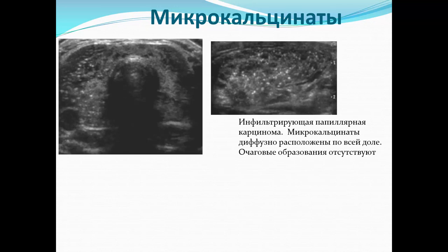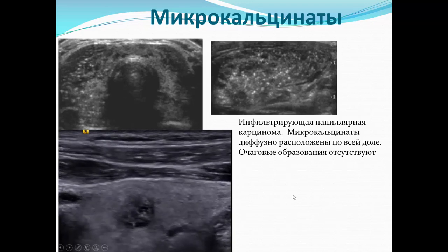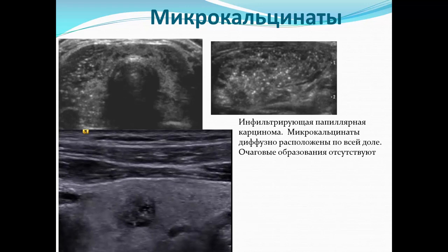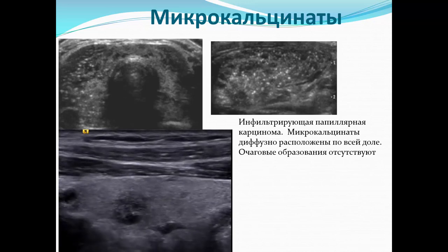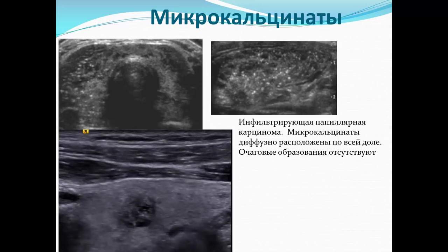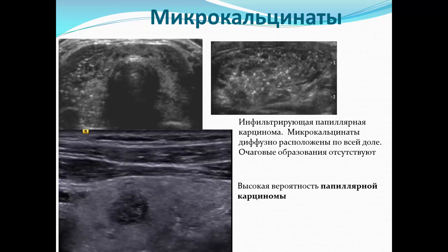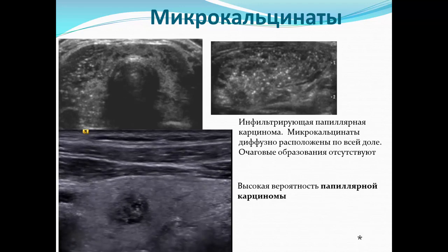Следующий пример — инфильтрирующая папиллярная карцинома: микрокальцинаты расположены диффузно по всей доле, очаговые образования отсутствуют. Видеопример демонстрирует небольшое образование менее сантиметра — очень важно, что мы часто сталкиваемся с такими малыми размерами. Разбросанные в структуре микрокальцинаты заставляют быть очень осторожными в плане вероятности папиллярной карциномы, и в заключении необходимо указать: «Высокая вероятность папиллярной карциномы, рекомендована тонкоигольная аспирационная биопсия».